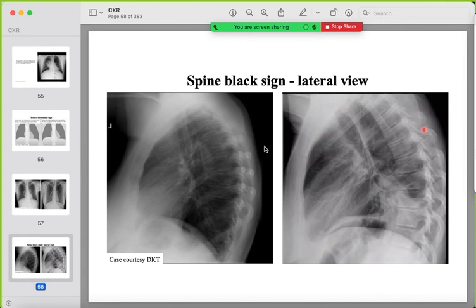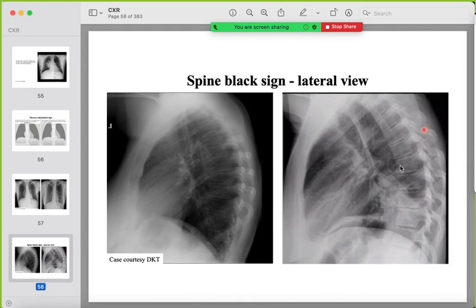The spine black sign is seen only on the lateral view. As you go down the thoracic vertebral bodies, they should appear progressively blacker. If a lower vertebral body does not appear blacker than the one above, suspect opacification of the overlying lung. In the abnormal example, the vertebral bodies appear denser rather than blacker as you go down.